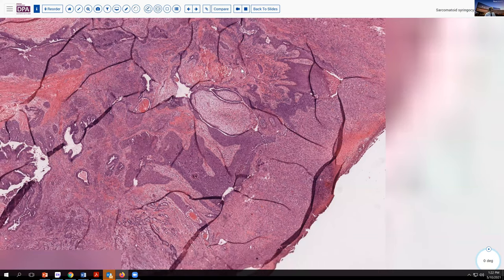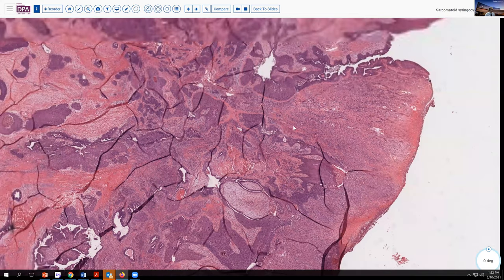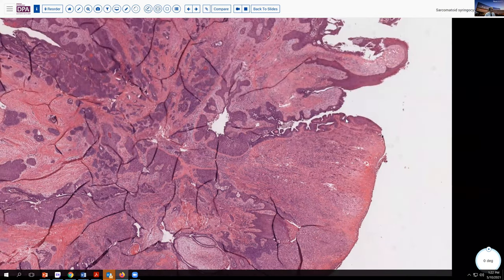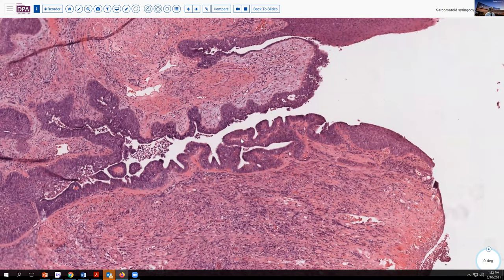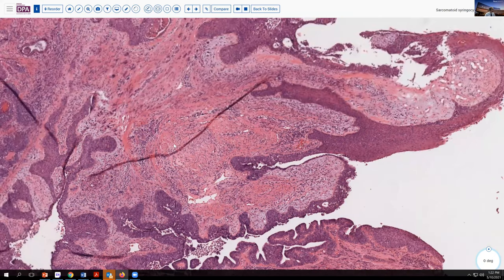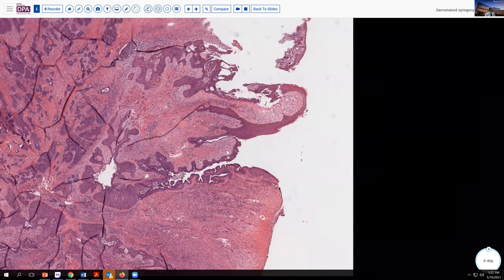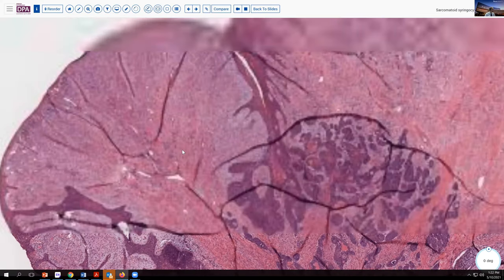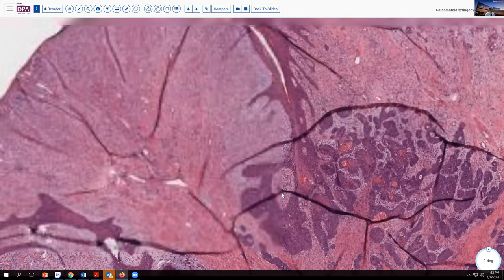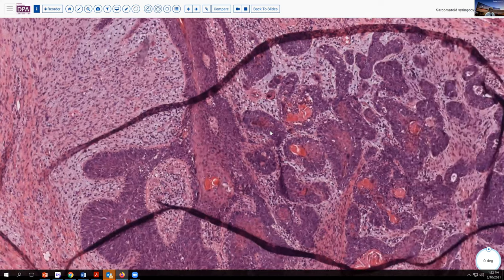So if we were thinking this might be a solitary rectal ulcer, I think we'd want to think again. Notice here we have surface involvement by the neoplasm. And here we see a little papillae in some of these ductal-like structures, as well as this spindle-shaped stroma associated with it in areas and a little bit of vascular ectasia. Let's look further at this area, emphasizing this more squamoid surface with underlying areas of squamous differentiation here.